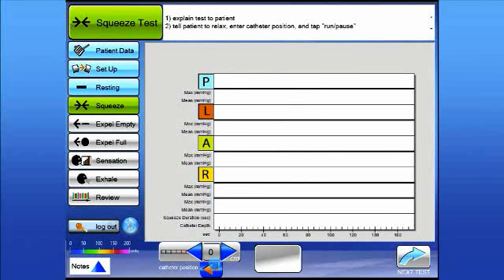You will see a 5-second delay before the Run button comes up. The 5-second delay allows the mcompass to take an initial reading before the patient begins their squeeze. Each squeeze should last for 20 seconds, and then there is a 1-minute wait between each squeeze. The system is capable of handling up to 5 different squeeze tests at each catheter position. Most patients will do 1 to 3.